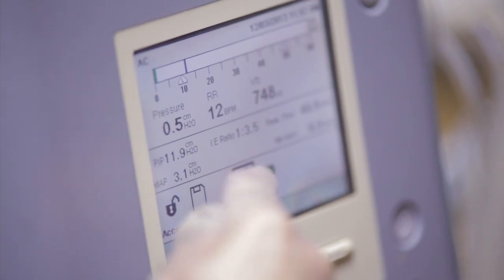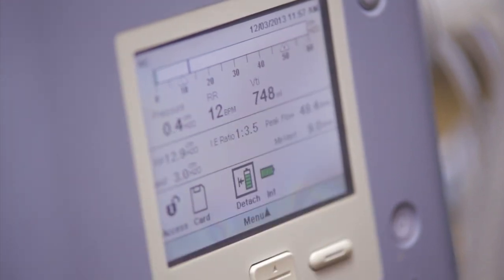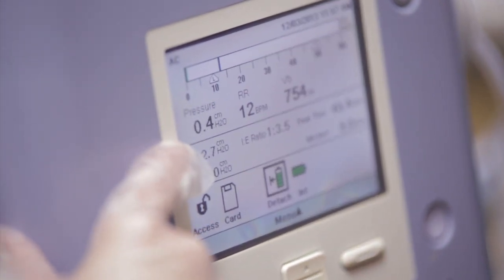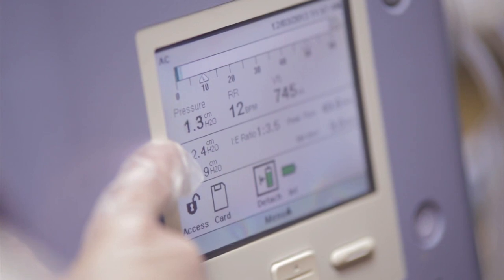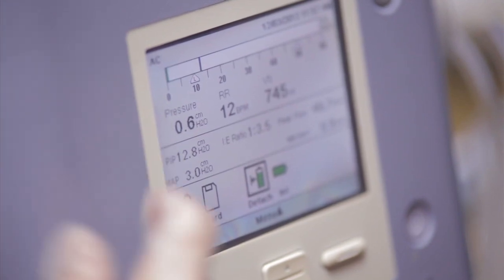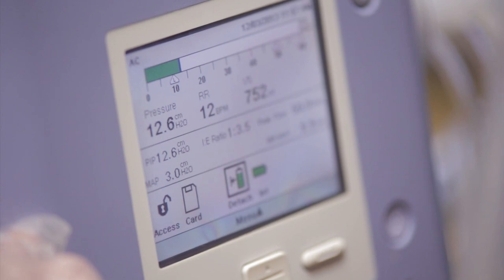With the valve in line, the vent is showing your tidal volume is 745 milliliters, which is only 5 milliliters less than target, and your rate is 12 as set. Before we started, your peak inspiratory pressure — PIP — was at about 16, and you are now at about 12.5 to 12.7. Technically, I could change your tidal volume on your ventilator to make sure you have the same PIP pressure as before.